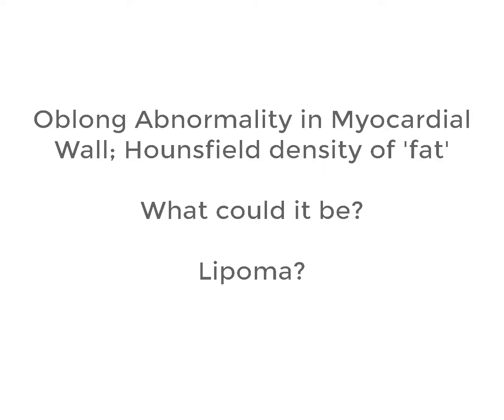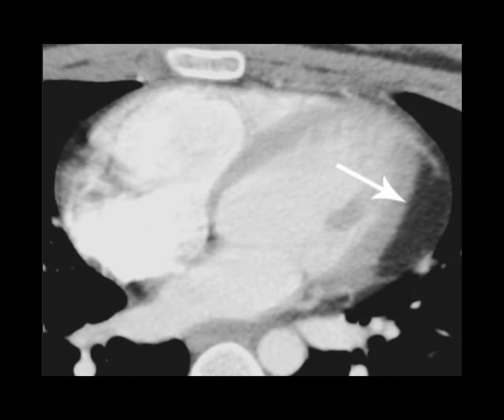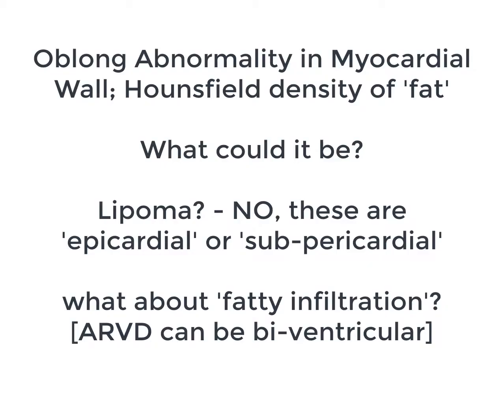What is this? Could it be a lipoma? That is the most common non-cancerous lesion of the heart. Here is an example of what a lipoma looks like. You can see at the arrow, this is extraepicardial or subpericardial in nature. So it is not a lipoma.